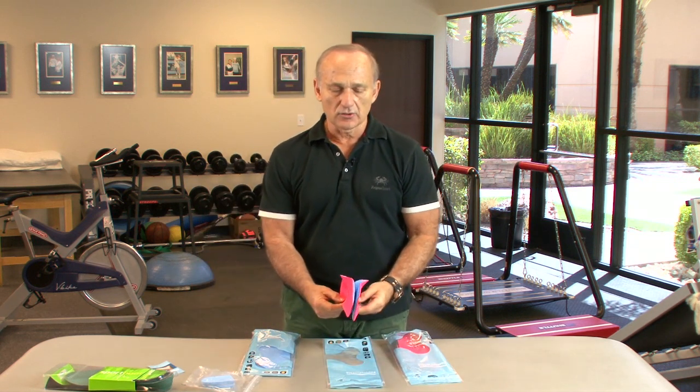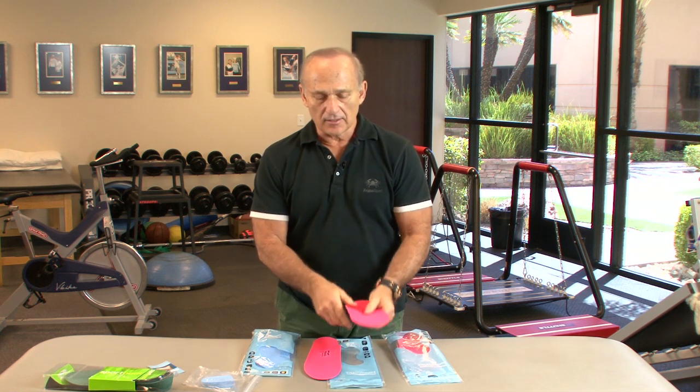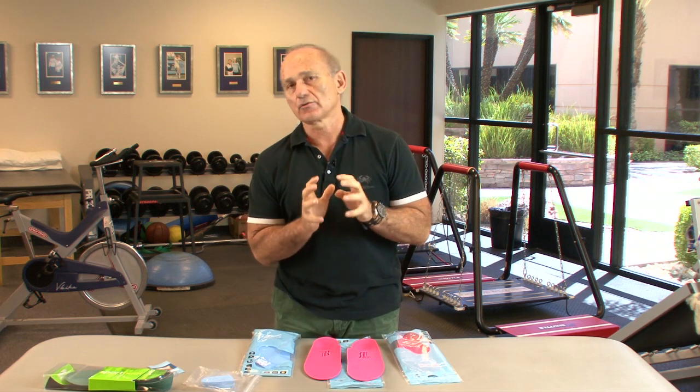So these I use, they're dual density, a little softer, and I think much more adaptable to patients, less active, but we want to control their balance and their function during the day.